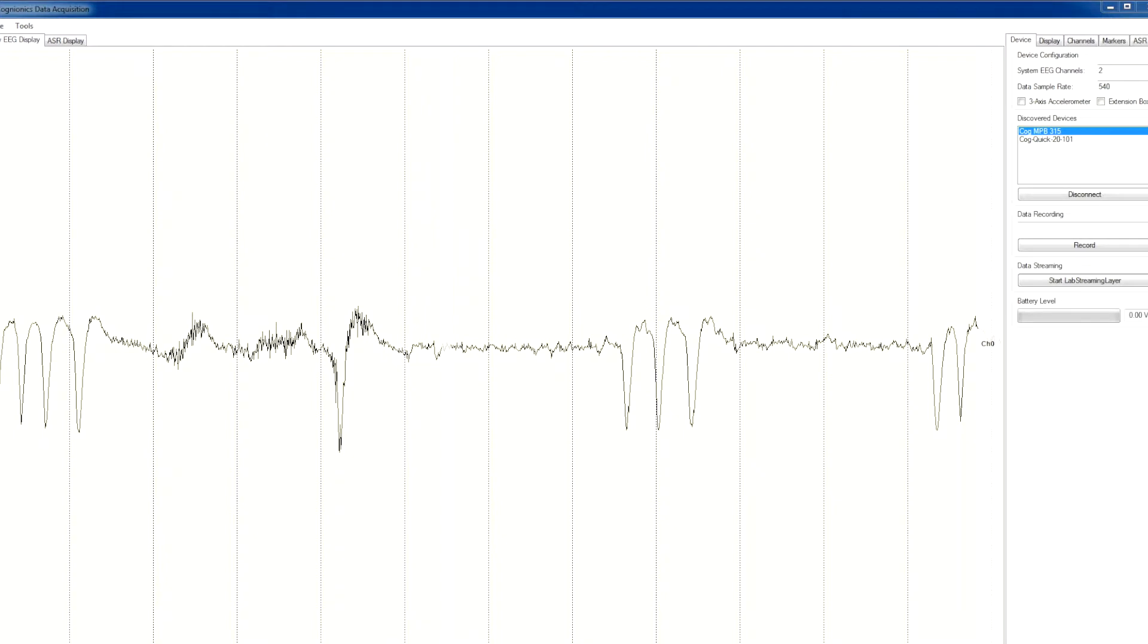You can see eye blinks, jaw clenches, and alpha wave activity when the subject closes his eyes.